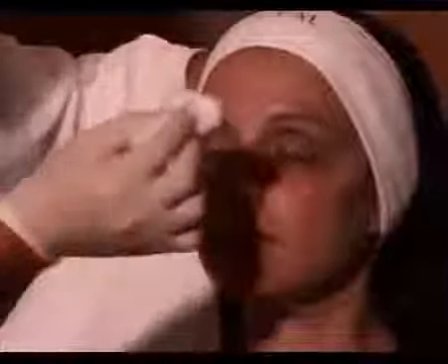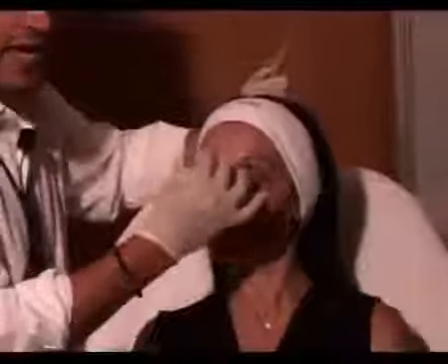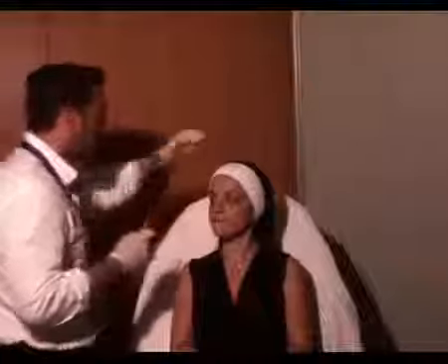All right, so cleaning the patient is very, very important. Some people like to use chlorhexidine, some like to use alcohol, and I've seen some use betadine. I kind of like alcohol, because alcohol is very quick and also has an antiseptic effect. Even though chlorhexidine is okay, remember it is ophthalmotoxic, toxic to the eye, and also ototoxic, toxic to the ears. So I try to avoid cleaning that area with chlorhexidine.